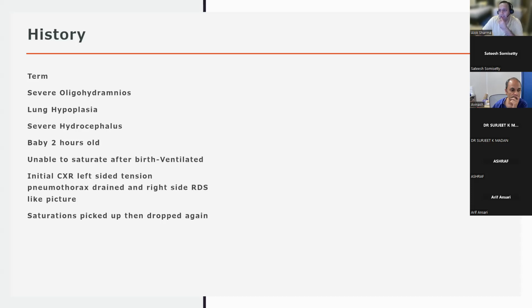So let's say that the radiographer has just left. So you are going to perform a lung ultrasound. So just protocol, what kind of scan are you going to do? Are you going to do a limited anterolateral scan? Would you like to do a comprehensive scan?